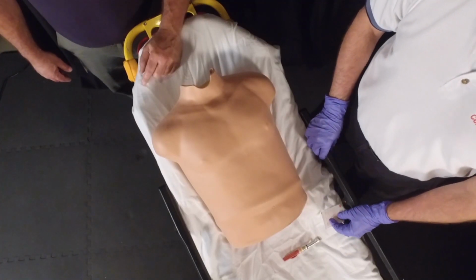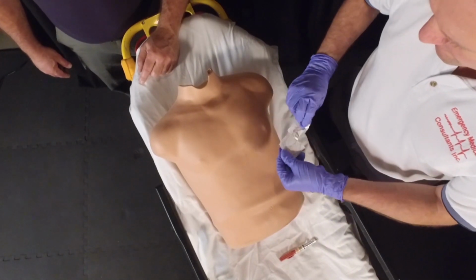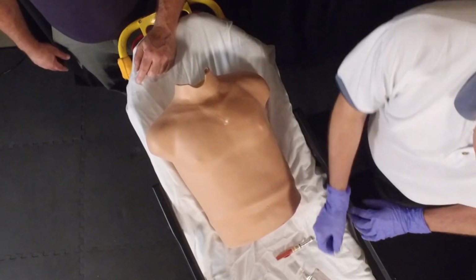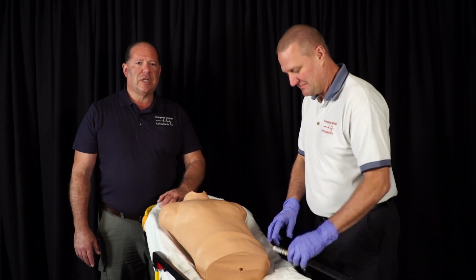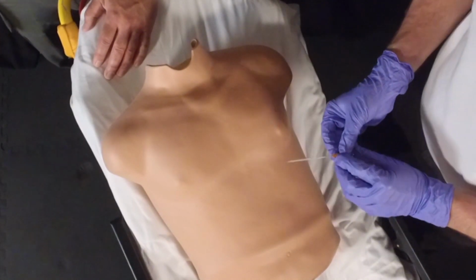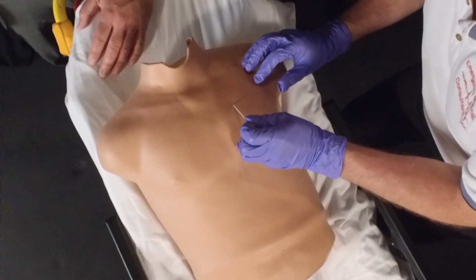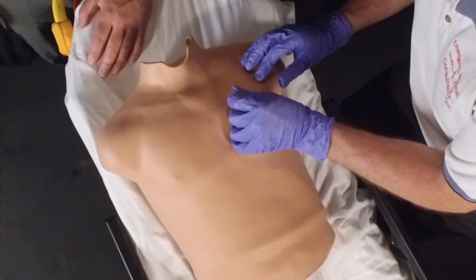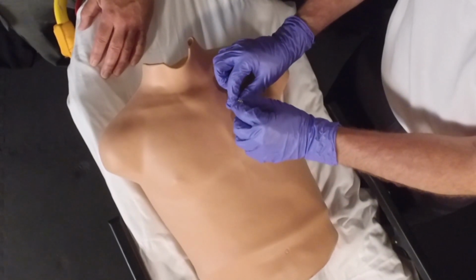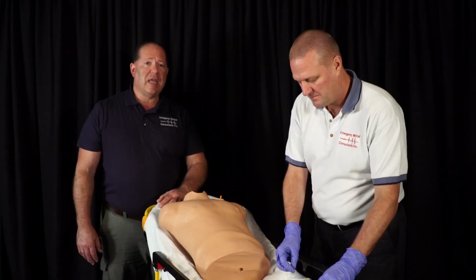Prep the site that you've already found at the second or third mid-clavicular space with the choice that you use, chlorhexidine, betadine, or whatever you use in your system. Once that's done, remember that the needle should be placed over the top of the rib. So find the top of the rib and angle it very slightly over the top of the rib and push it through the pleural cavity. Remember that this needle is going to go in all the way. Once the needle is in, remove the needle, leave the catheter in place, and in reality, that's all you need.